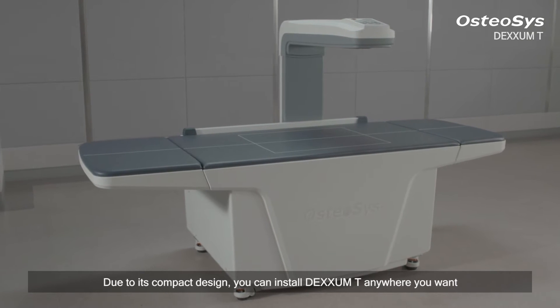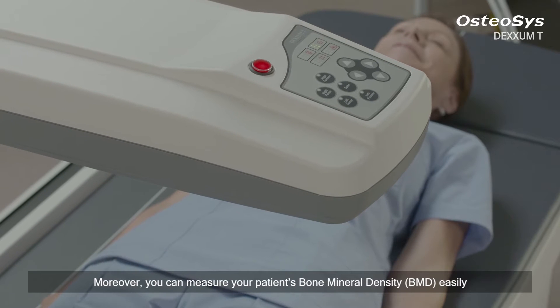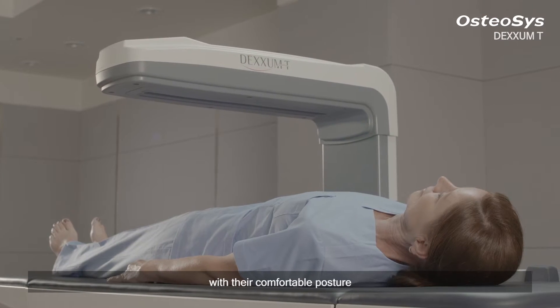Due to its compact design, you can install DEXXUM T anywhere you want. Moreover, you can measure your patient's bone mineral density easily with their comfortable posture.